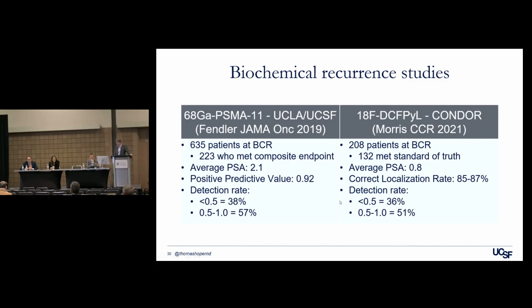And the detection rates you can see here based on PSA are very similar. The correct localization rates or positive predictive values are very similar. Again, just like the initial staging, these two imaging agents function nearly identically and should be thought of as interchangeable.